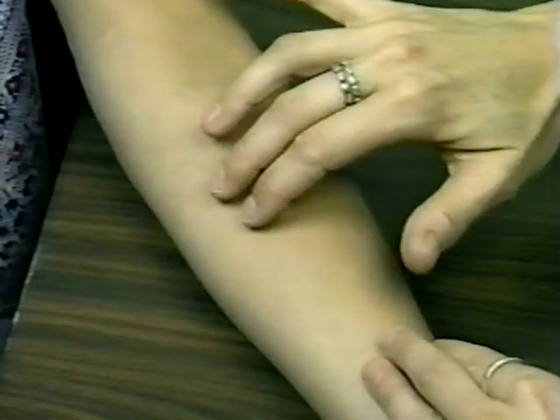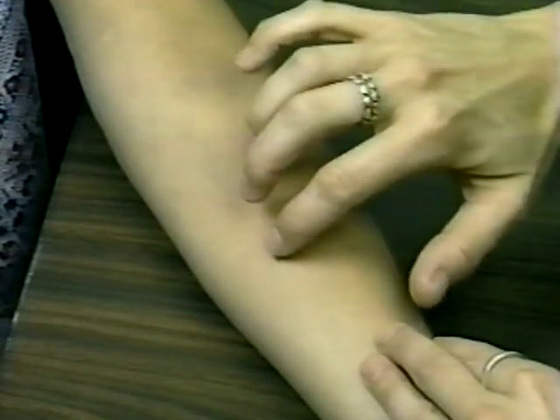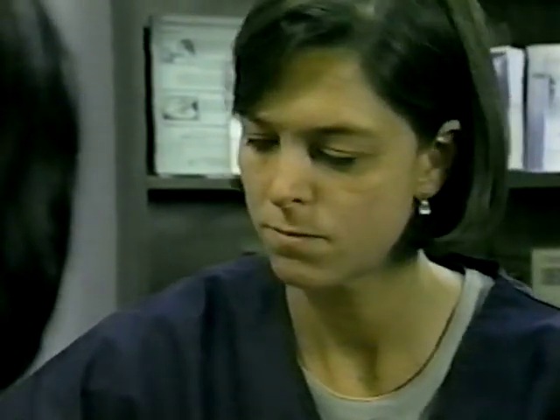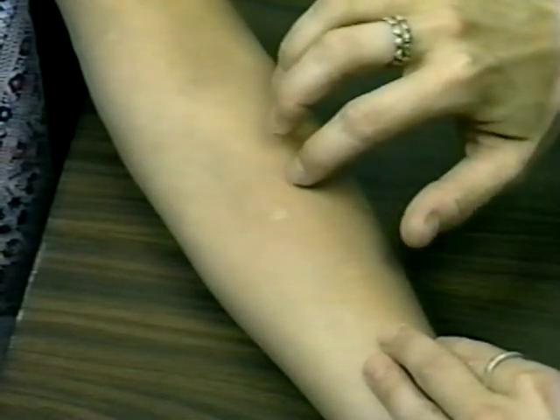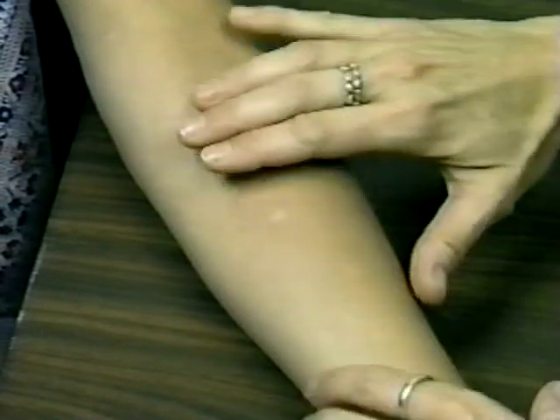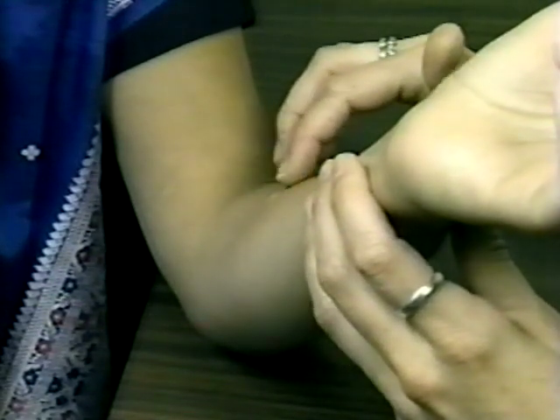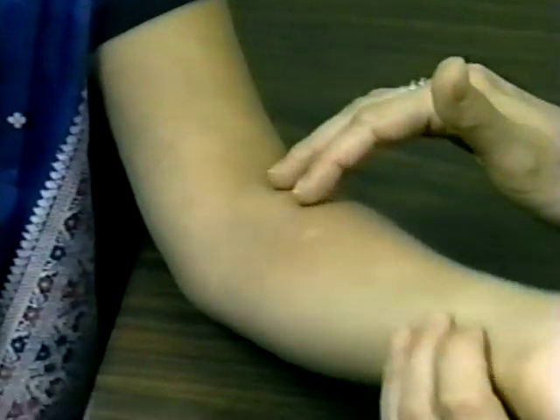If induration is present, use a zigzag feather-like touch over the area of induration to outline its margins. Determining margins all around the induration helps find the edges, which will be measured later. When palpating for margins, be careful not to confuse a margin of induration with a margin of muscle on the forearm. To check this, raise the patient's arm to a 45-degree angle and palpate again — you should still be able to palpate the margins of induration.